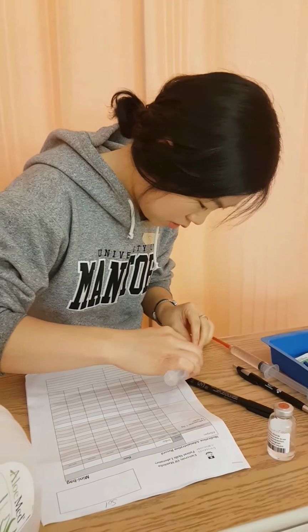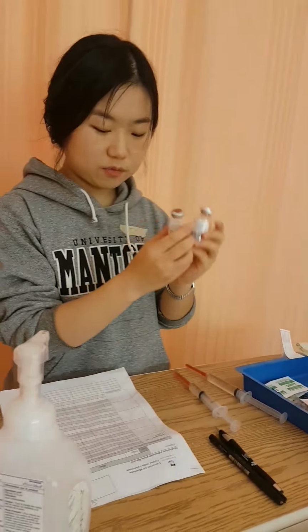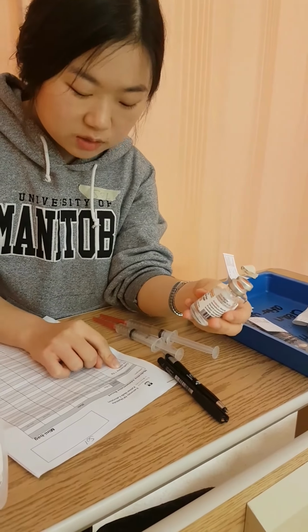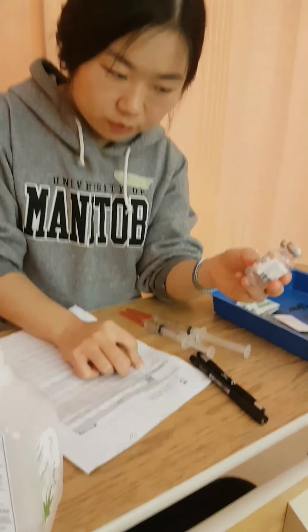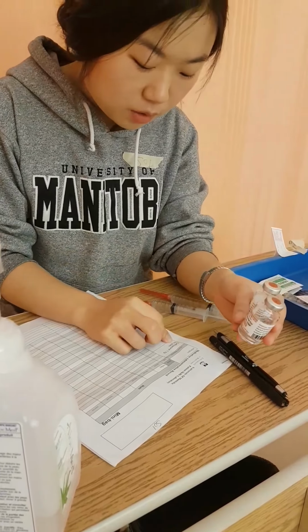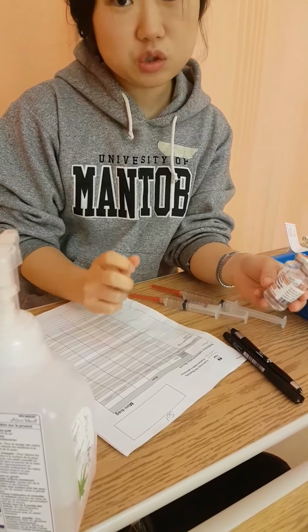Alright, so before I dilute it into the mini bag, I'm going to do my second med check. So here, my vials and my MAR and my syringes. This is for the patient, Mr. John Smith, who has no known allergies. The drug name is Ceftriaxone. The ordered dose is 1.5 grams, so I have my 15 milliliters, which equals 1.5 grams here. The route is through IV infusion, and the time is every 24 hours, and it's due now.